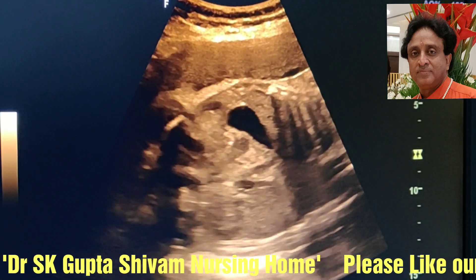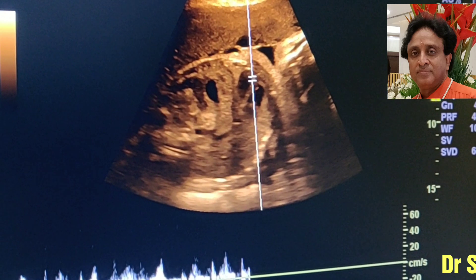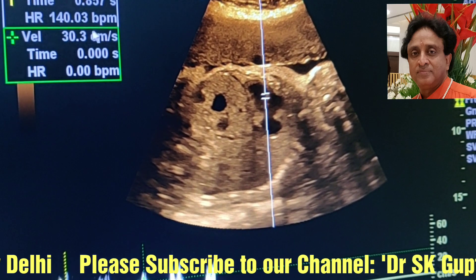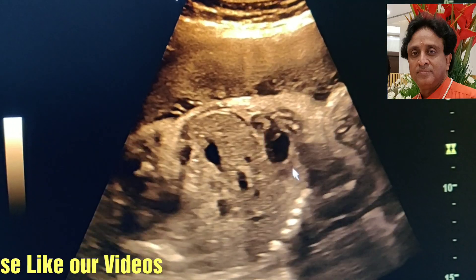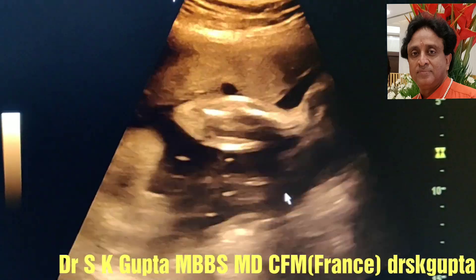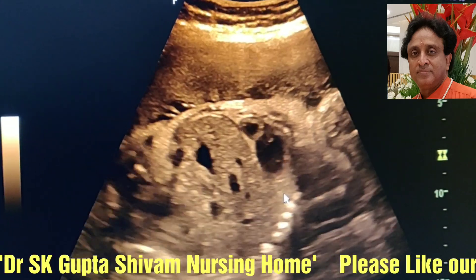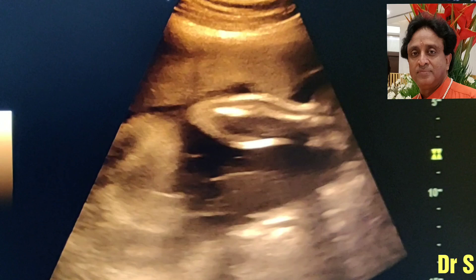The second parameter is an increase in the fetal heart rate over a 30-minute period. There should be 2 episodes of fetal heart acceleration associated with movement. The fetal heart should accelerate by 15 beats per minute — here the baseline is 140 beats per minute. When the fetus moves, try to record it, and the fetal heart acceleration should be sustained for about 15 seconds. If this happens, a score of 2 is given; if not, the score is 0. In Manning's calculation, each parameter is scored as either 2 or 0.